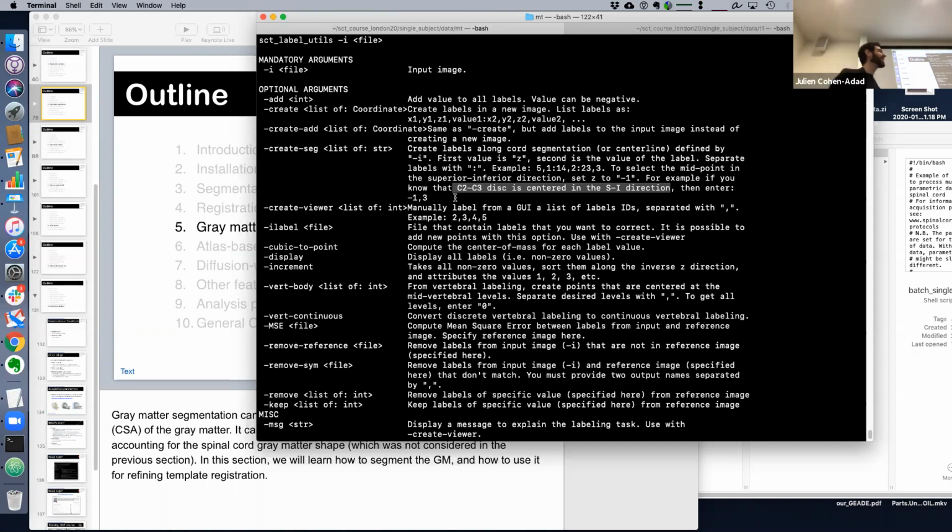A quick question. For running DeepSeg, how much memory is recommended? DeepSeg is the most aggressive one in terms of memory. First of all, it depends on the size of the image, so there is no single answer. We have a GPU. You can send it to the GPU. No, it's running through the CPU. How much RAM do you have?